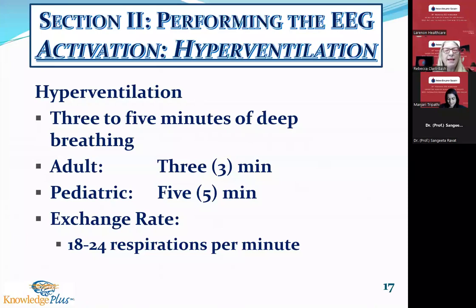And I remind them every 30 seconds, you have a timer on your EEG machine. I remind them every 30 seconds how far they've come. Helen, we're at 1 minute. We have 2 minutes to go. I remind them how much work they have left. 3 minutes is a long time.